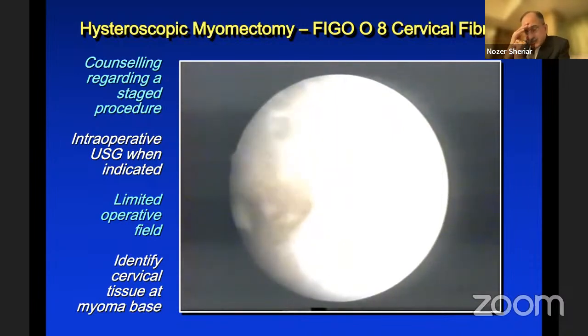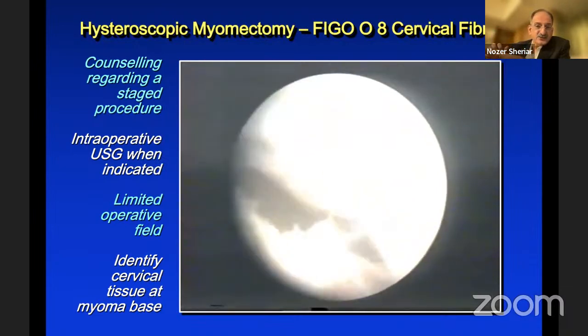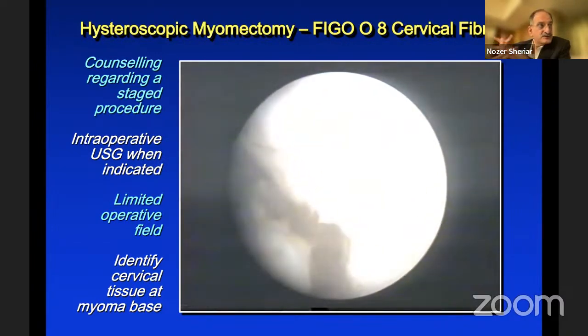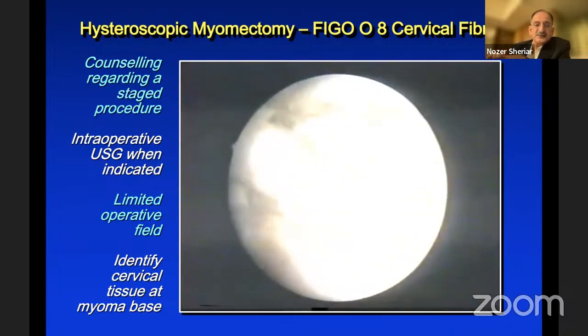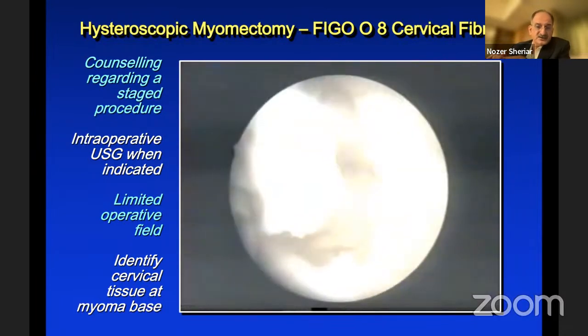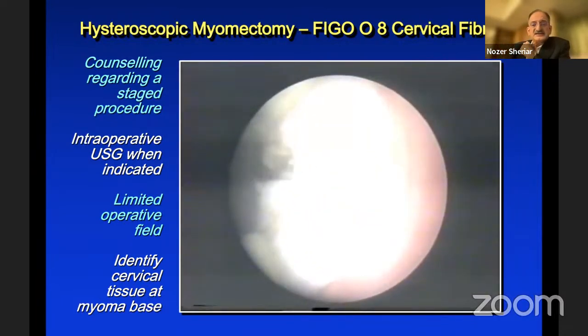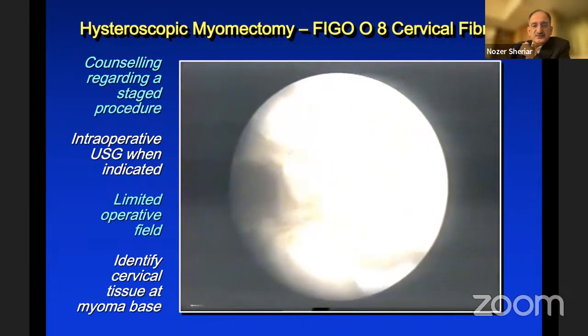Here I must also tell you that when it comes to cervical ectopics, I don't think there's any better way of doing it than a hysteroscopy. We've got about 7 or 8 to date. And now for me, hysteroscopy has become the primary tool for dealing with the cervical ectopic, and patients can pretty much go home soon. And you can see that edge where the myoma's edge is seen from the cervix, and you've gone and completely stayed in, cleared it out.